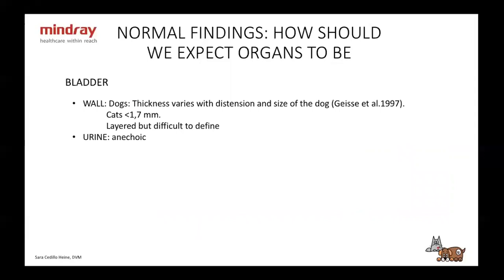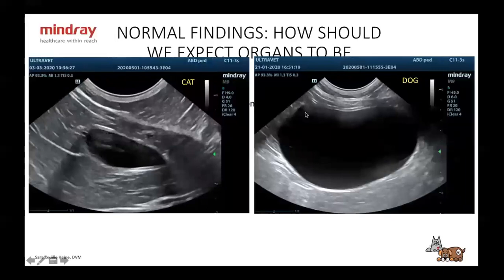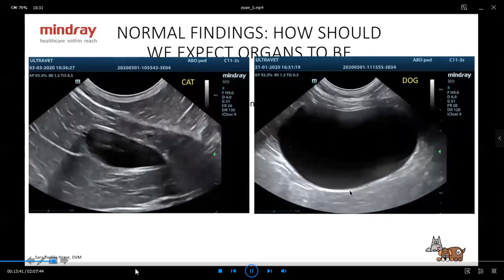Let's start with the bladder. The wall thickness in dogs varies with distension — this is important because if you have an empty bladder, you might think it's very thick when it's not. In cats it should be less than 1.7 millimeters. It is layered, but sometimes it's very difficult to find. The urine should be anechoic. On the left we have a cat, on the right a dog's urinary bladder — very thin wall, with layers that are difficult to see when completely full.